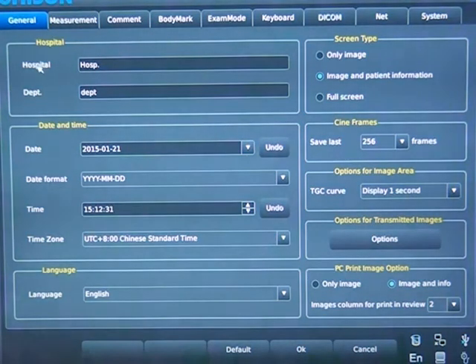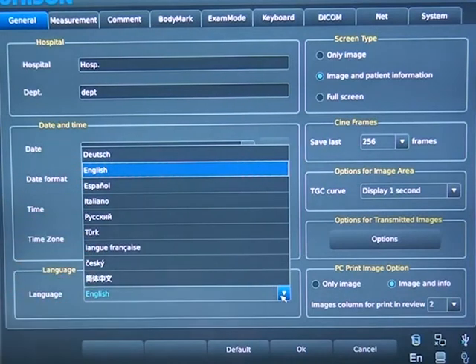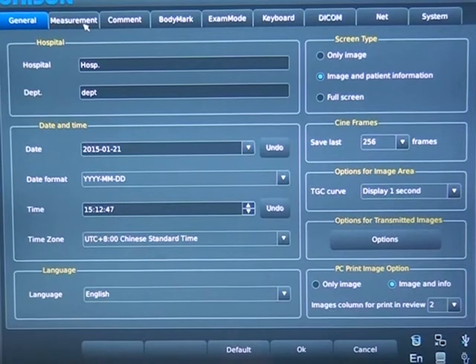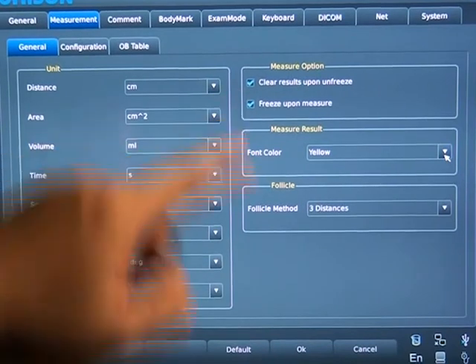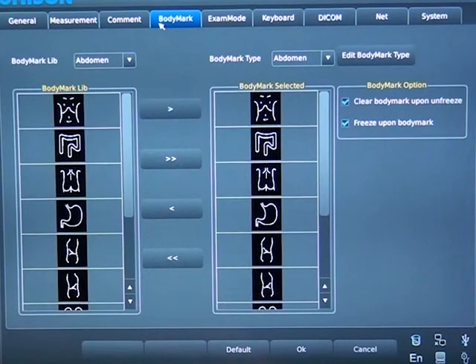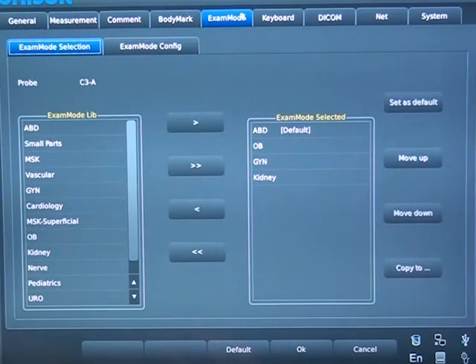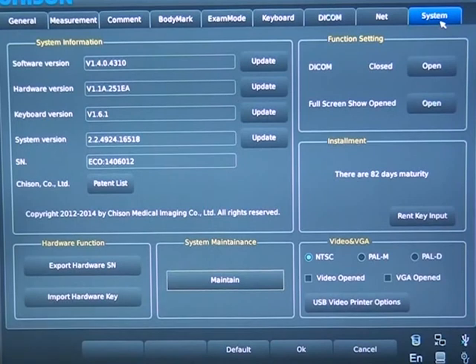Press Setup to configure the system as you wish. In the General interface, we can set hospital and department, date, time, and time zone. We can also choose the language without restarting the machine. In Measurement, we can choose units for distance, area, volume, and so on, and set the color of fonts and two measure options. We can add measurements or adjust the rank of different regions. Then, in Comment, Body Mark, and Exam Mode, we can define them according to custom preferences. Finally, we can update both software and hardware in System Information — provide the SN of your machine to us and we will make the latest software and hardware. That's all. Thank you.